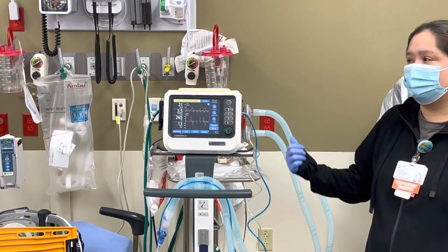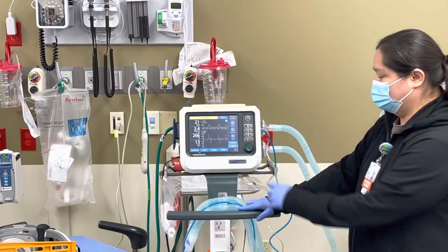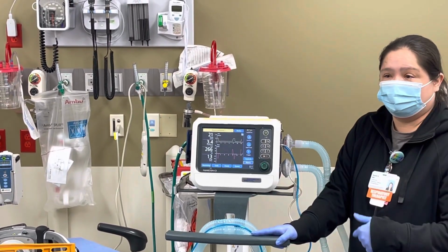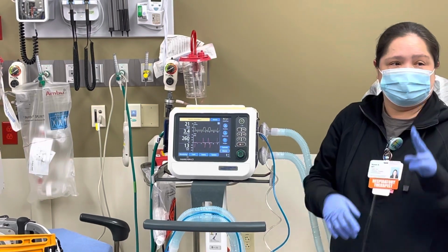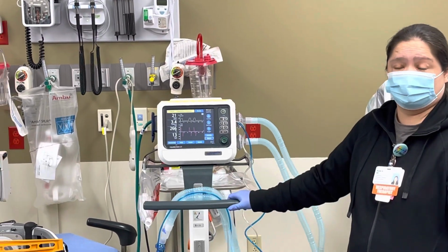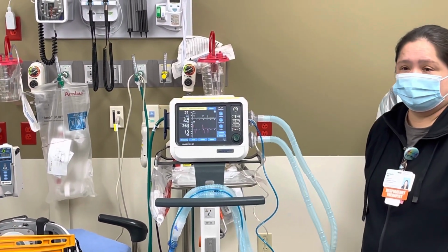So I can send a message out and let them know, because basically what this is telling me is that normally down here at the bottom there should be two little batteries, one, two. Right now, this one's running off of one. So whenever you unplug this, you're only going to have one backup battery versus the two, which will run a little bit faster. So I'd make sure it's plugged in, and I'll reach out to Peak. Okay, thank you. You're welcome.